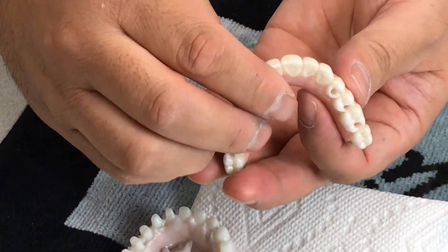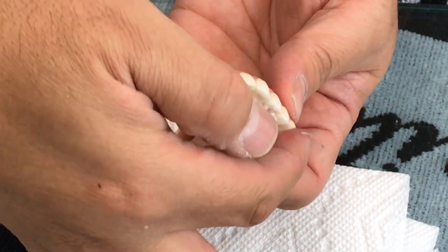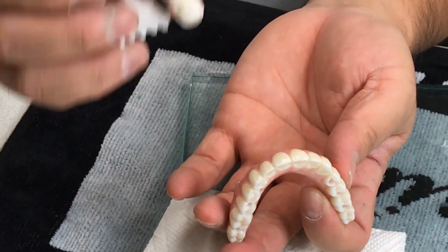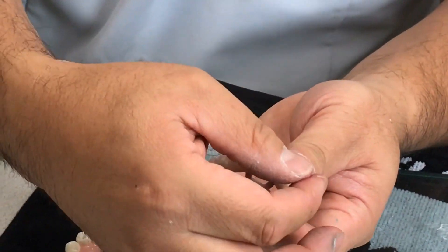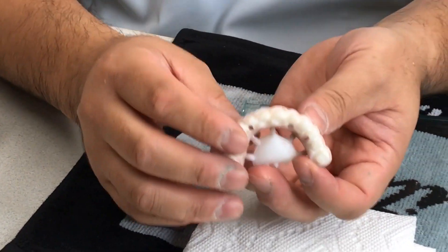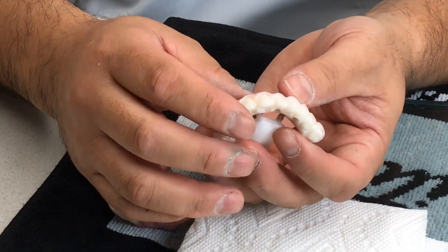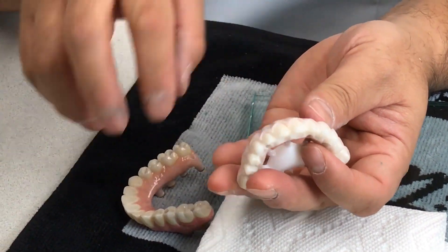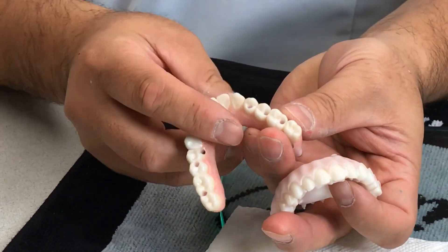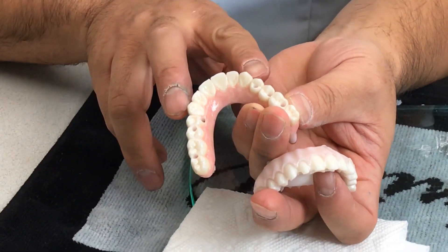For this case we mill the crowns in three pieces: anterior and molars. First we finish the base, then we scan the base one more time and make the crowns over it. The crowns are in three pieces — a molar four-unit bridge, another four-unit bridge splinted, and a six-unit anterior splinted bridge.